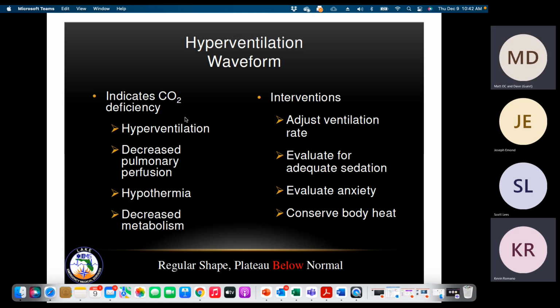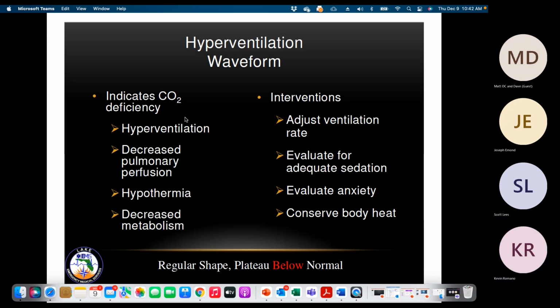These Zoll monitors, for services that have Zolls, you have the ability to get different monitoring probes. They have esophageal, rectal, and skin probe temperature monitoring that you can do for continuous temp monitoring. Again, they cost money, but if you're doing a long distance transfer, especially with an intubated patient, having the ability to do esophageal temperature monitoring may not be a bad idea for hypothermic patients.